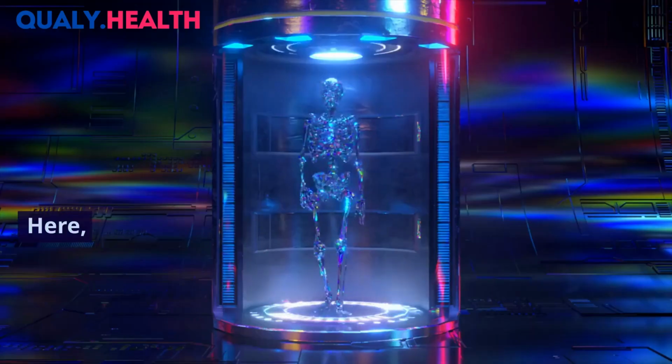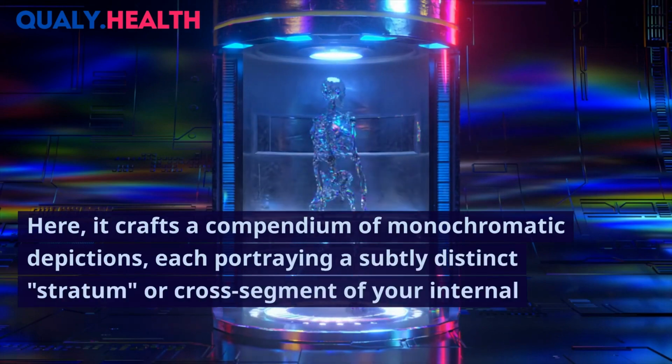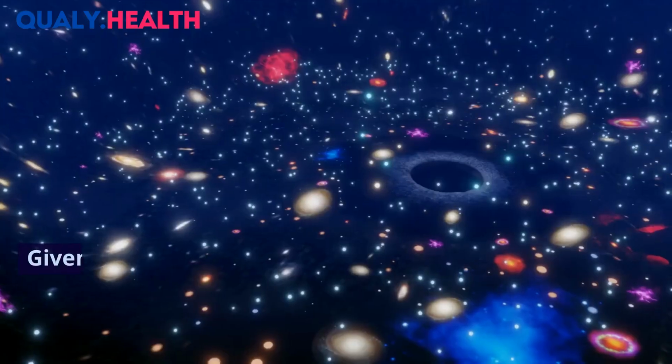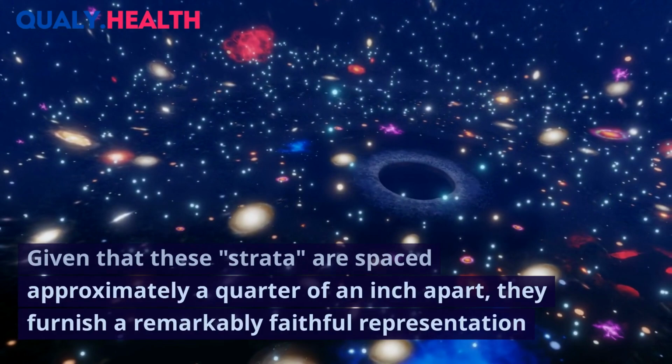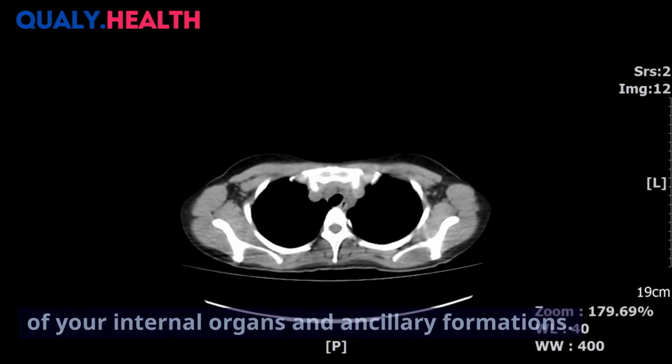system. Here, it crafts a compendium of monochromatic depictions, each portraying a subtly distinct stratum or cross-segment of your internal anatomical structures. Given that these strata are spaced approximately 1/4 of an inch apart, they furnish a remarkably faithful representation of your internal organs and ancillary formations.